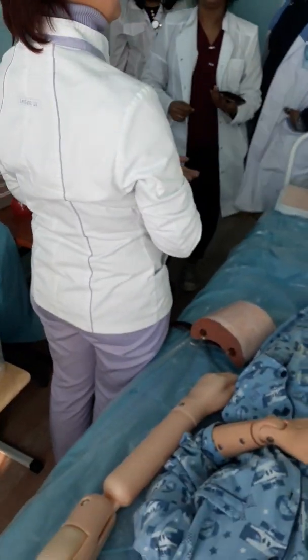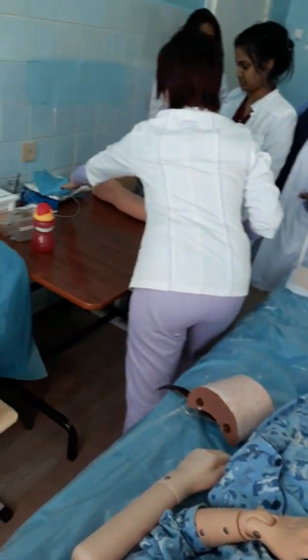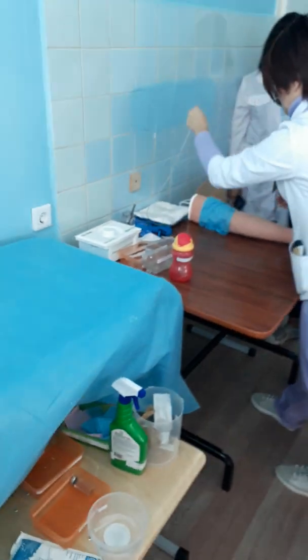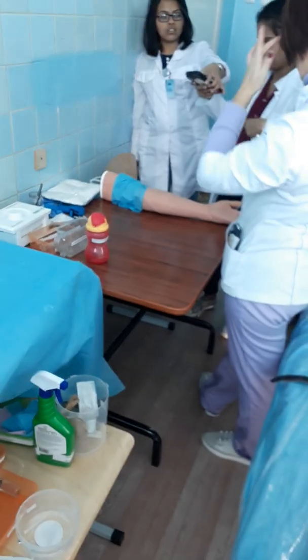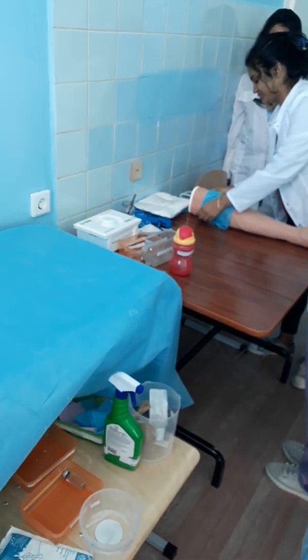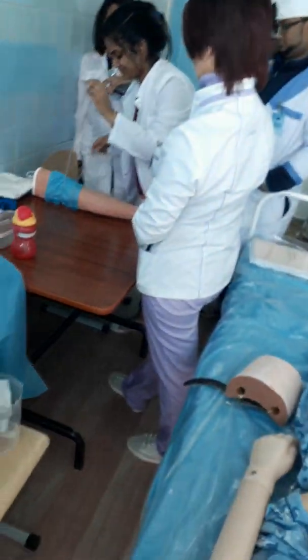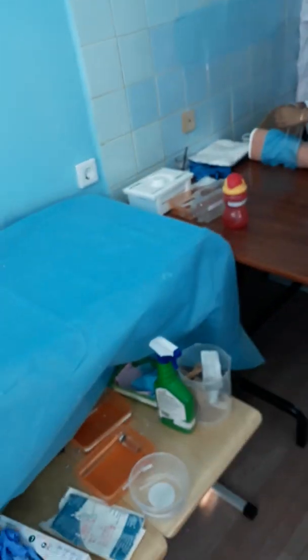Is it easy? No, can you practice again? Please, you try to do it. Yes, like this.